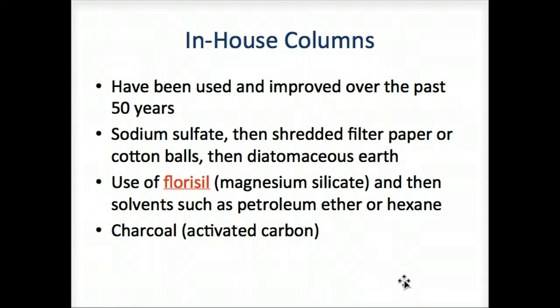In-house columns. These were developed by toxicologists in the 1960s and 1970s. They were first columns of sodium sulfate to just absorb water. Then toxicologists started using shredded filter paper or cotton balls to trap drugs. Blood would be poured into the column first, followed by a solvent to recover the drugs. Following this, toxicologists started using other materials such as diatomaceous earth, a sedimentary rock of marine or lacustrine deposition composed mainly of silicon dioxide. These materials were loosely packed in columns.